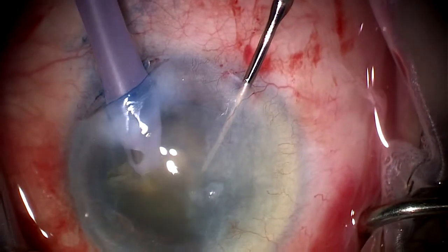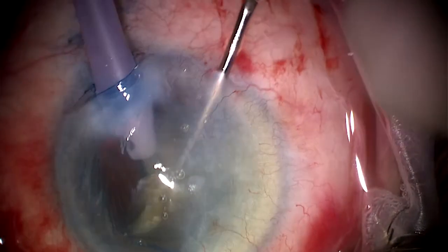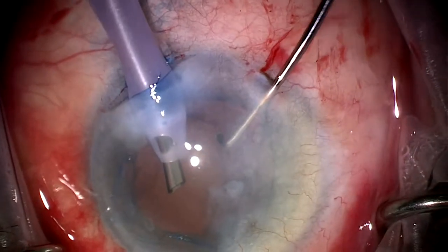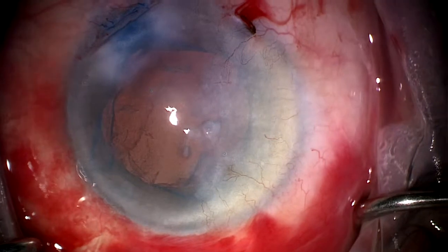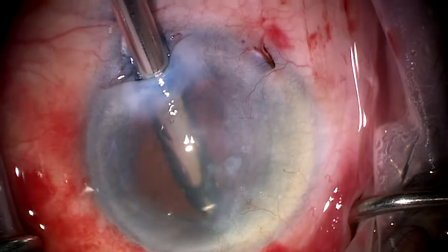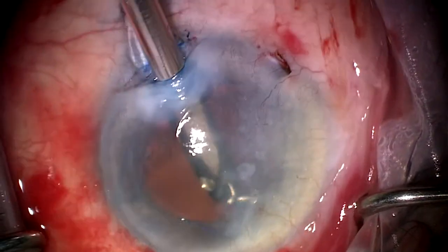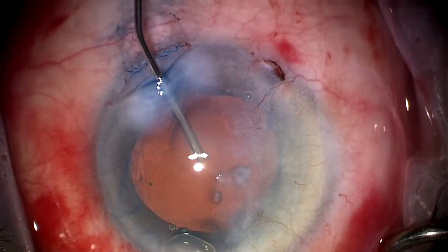Once we've removed the lens using the FACO device — just getting the last segment here — we are ready to perform a cortical cleanup. Cortical cleanup in this case should be relatively straightforward. The point to note here is that the capsular edge under the opacified cornea is visible because of the capsular stain, and in order to engage the cortical material in this area, it's sufficient to go under this area and engage the vacuum on the device so that we can get hold of the cortex. We do have to be a little bit careful because obviously the view here is compromised, but we managed to get the cortical material in this area relatively easily.